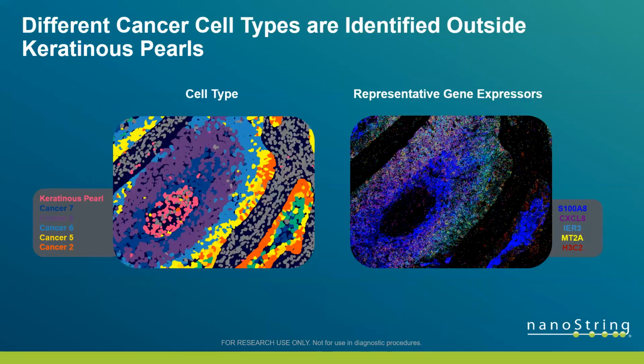So this cell typing that we found showed many of these different cancerous subpopulations, which were revealed spatially from cells that lack really any defining marker genes. What we found was that we matched the structure of these keratin pearls, which we identified through an H&E stain for further verification. So this visual inspection shows the cancer populations revealed concentric rings, which is underscored by visualizing the most distinct marker gene from each cancer cluster as well.